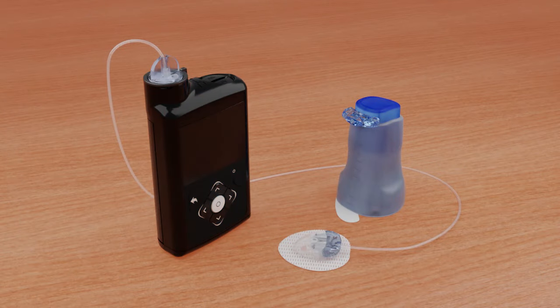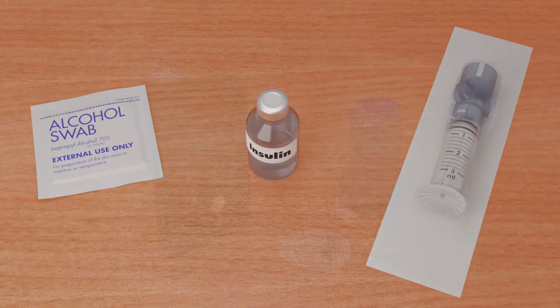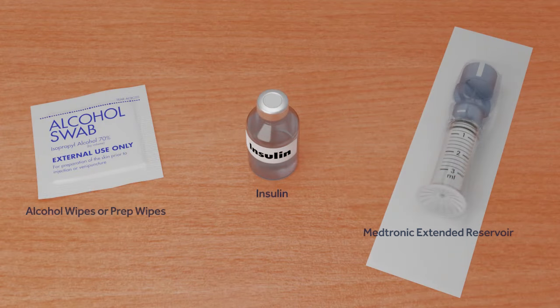The extended infusion set and extended reservoir can both be worn for up to 7 days. However, you may require more insulin than the extended reservoir can hold. In this case, you will need to change only the reservoir while keeping the same set. Before you begin, wash your hands and gather the items you will need to change only the reservoir.